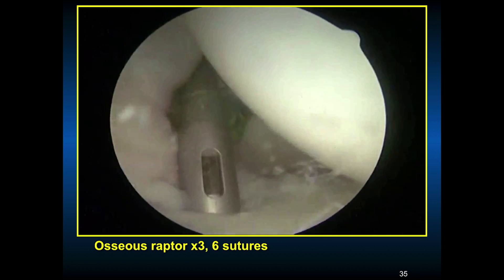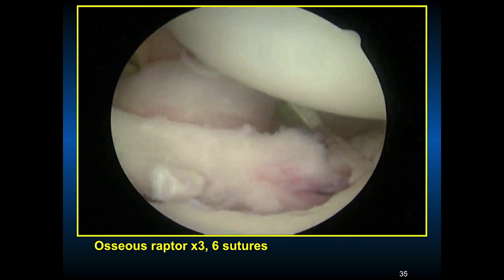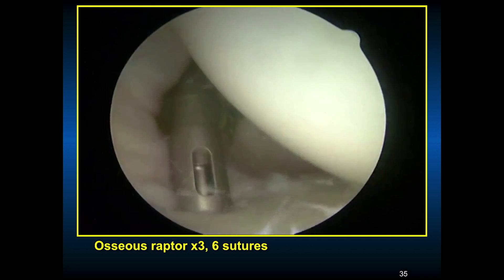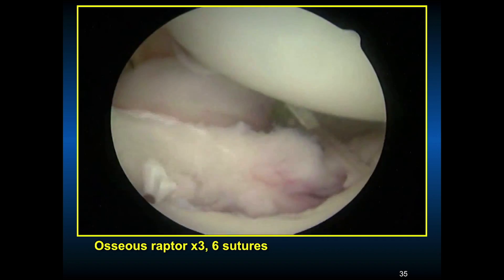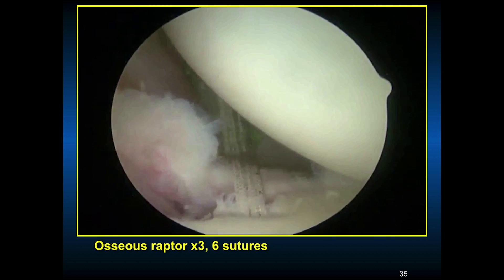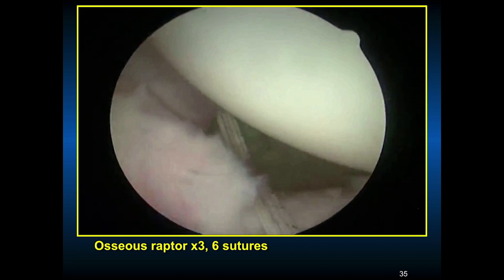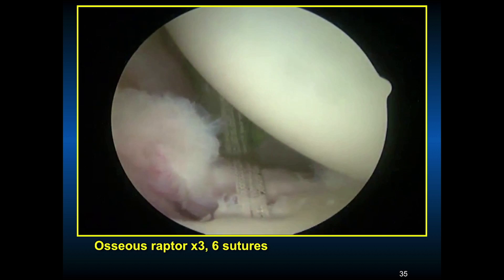At this time we were using an osseous raptor device with two sutures on it. Establish an anterior inferior portal. In this case, I left the scope in the back — tie as you go. If you have anterior inferior instability, start in that quadrant, tie your sutures down, and then go more superiorly. You can see the two cannulas — scope is in the back. There are different ways of passing these sutures: through the tissue using a nitinol or suture relay, or directly — retrograde and antegrade — using a parrot beak direct system.